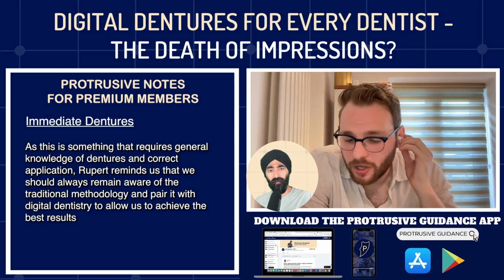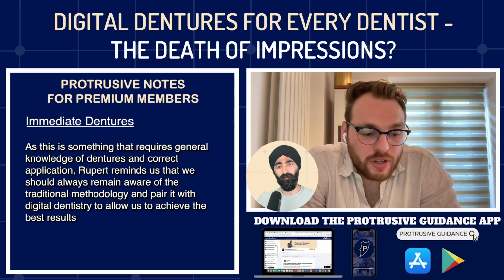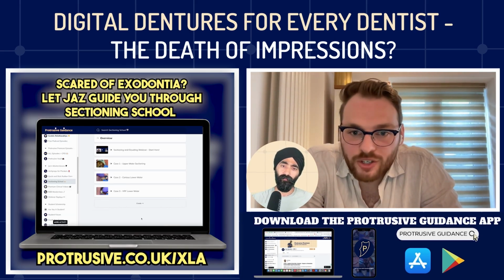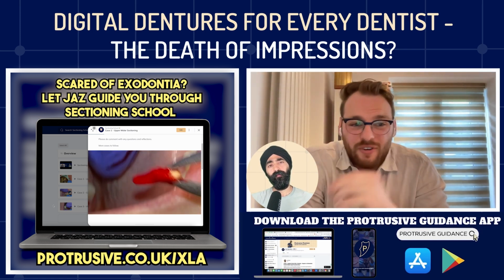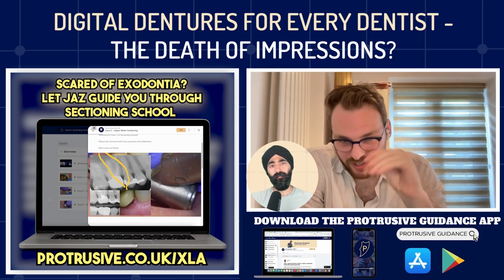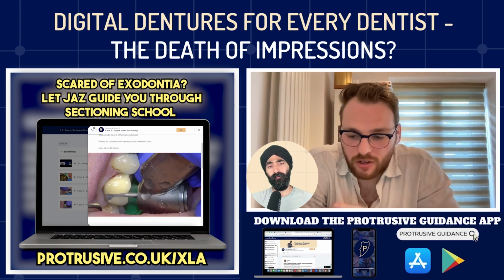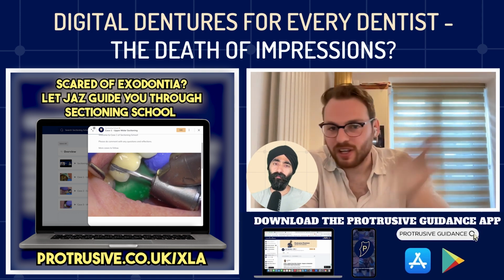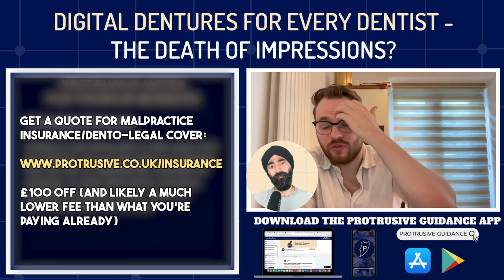Yeah, absolutely. So you could add to them exactly the same, no problem at all. The majority of the time, whenever I do an immediate, I've always got something like Viscogel ready to go. It's a soft temporary liner that is quite clever. It's sort of thixotropic, so it keeps drifting around where it needs to go. So yeah, you can still add to them. You could use chairside acrylic, you could use soft GC reline, silicone material, whatever you want to use. You could extend it again correctly.